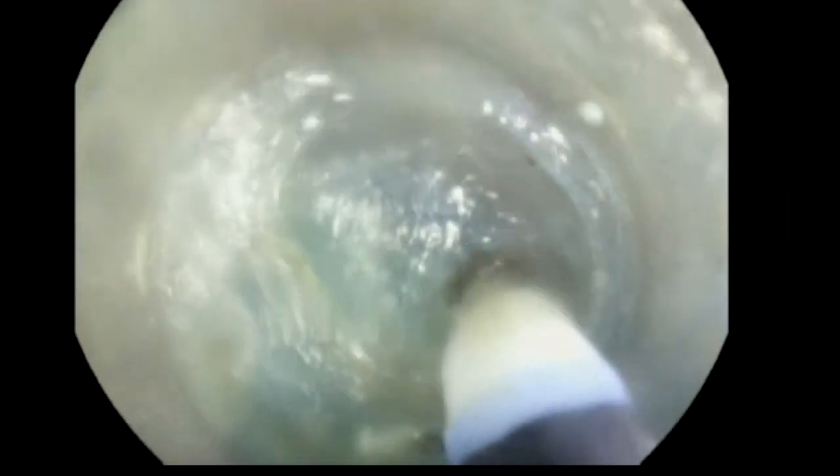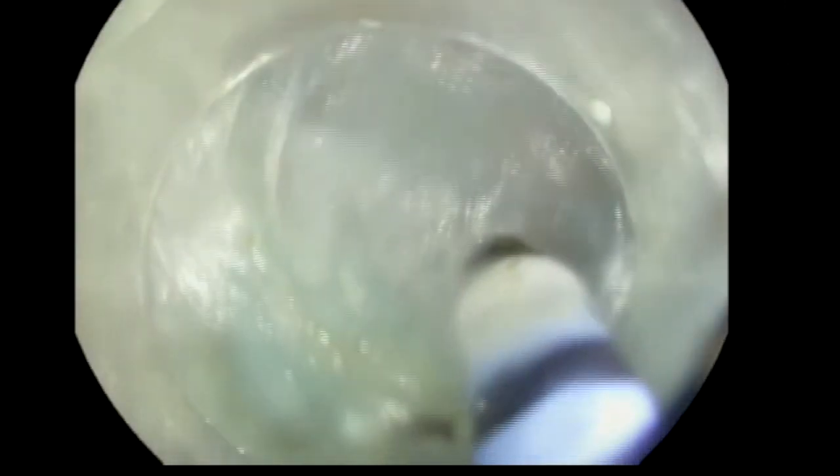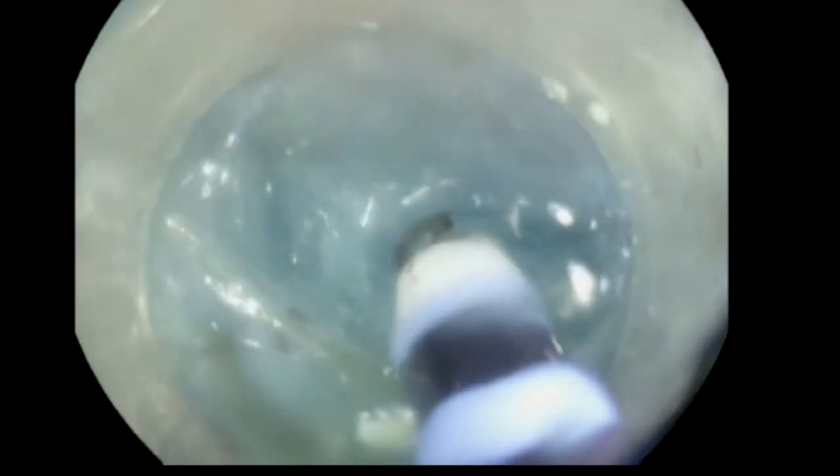That by itself will open the way for the endoscope to go inside the tunnel. Once we get inside the tunnel, you will carefully dissect towards the muscle layer. As you see here, when we are dissecting, we are leaving some submucosa next to the mucosa. That's to prevent any mucosal tear. So, we are hugging against the muscle when we are doing this submucosal tunnel.